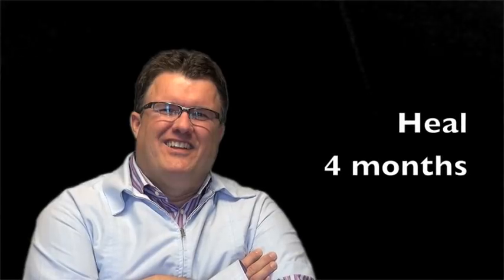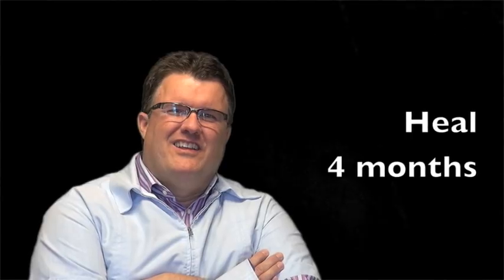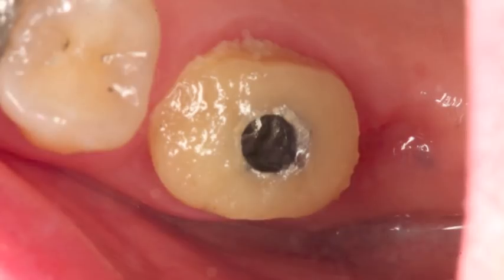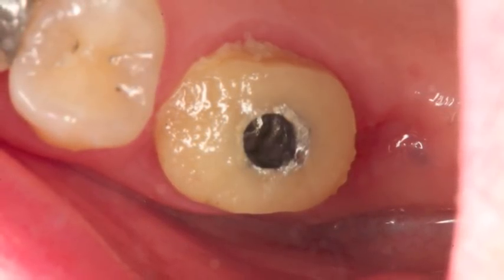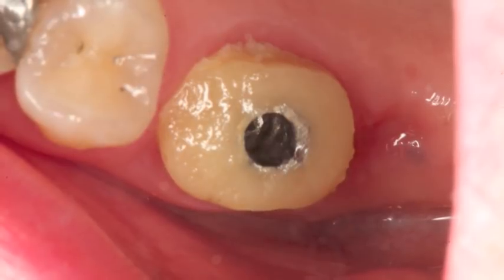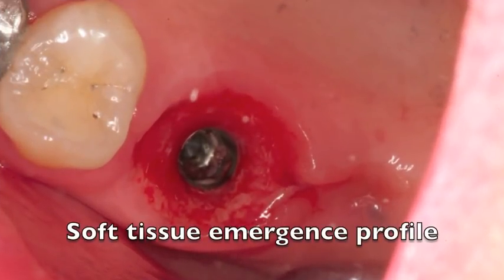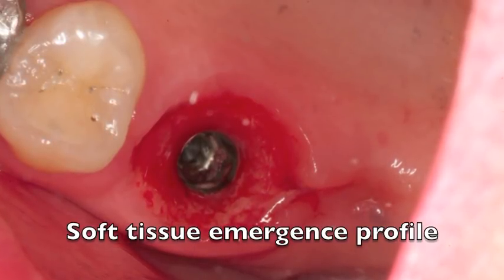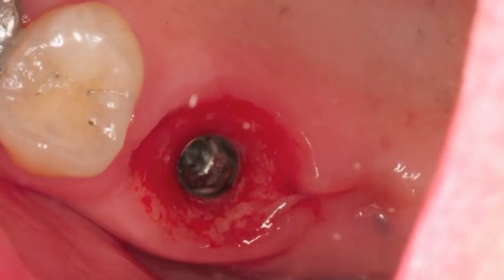So then we had to wait a little bit longer because of the bone grafting. The patient came back and we had this healing abutment on that was customized, and you can see that the tissue is actually healing quite nicely around it. Look at when I take it off — you get this kind of hemidesmosomal attachment occurring around this healing abutment, which is fantastic. This is exactly what we want for healing.